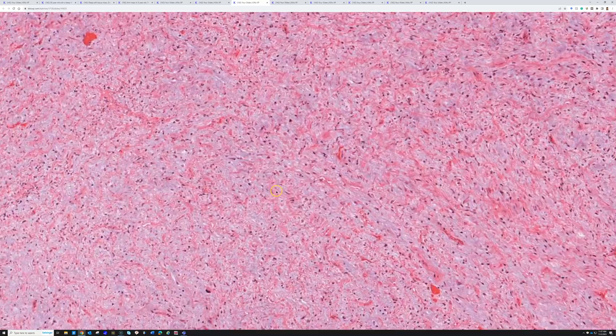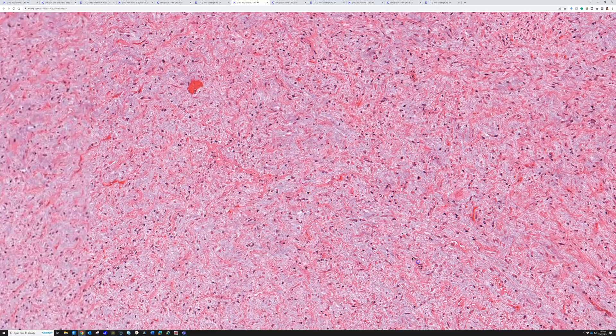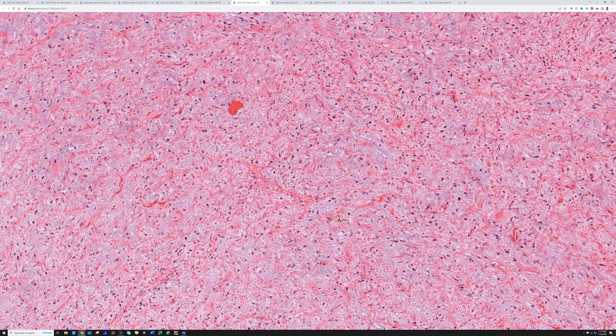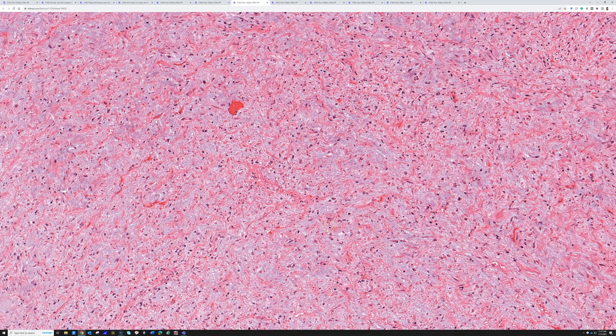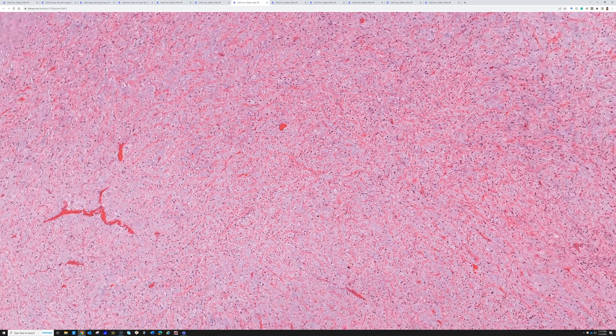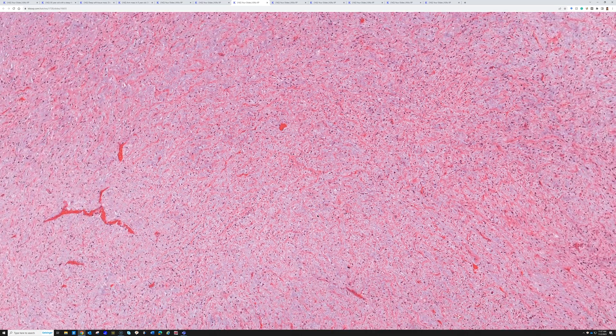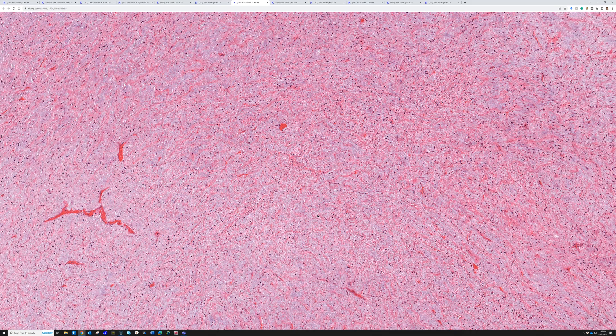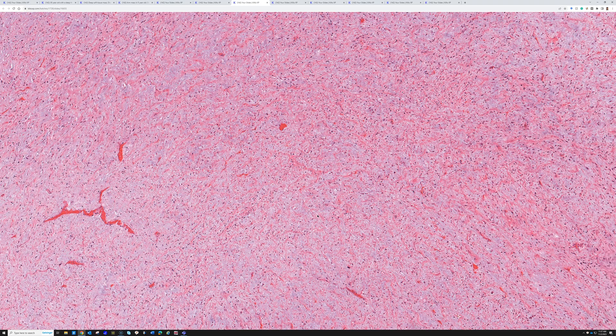There's one other pattern. Here's myxoid change, but look how bland. This area kind of looks a little bit like myxoid liposarcoma. Myxoid liposarcoma, though, is very rare in the retroperitoneum. It's usually in the extremities. If I think I see myxoid liposarcoma in the retroperitoneum, it's almost always going to end up actually being a de-diff liposarcoma, or maybe a well-diff with myxoid change.